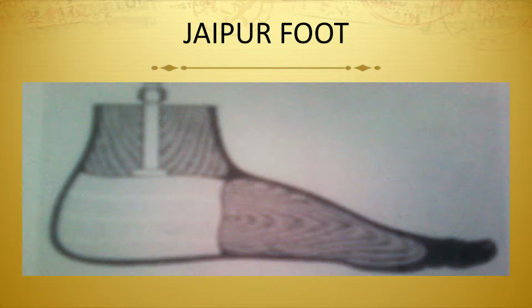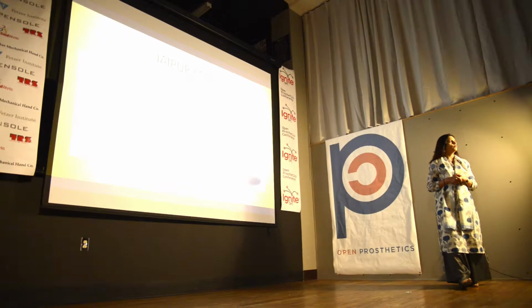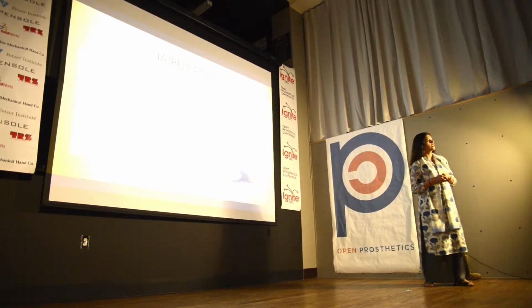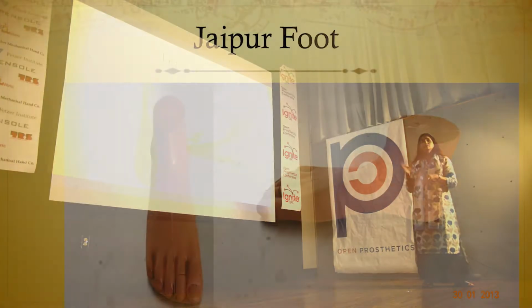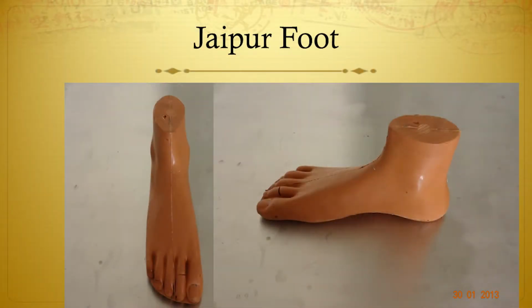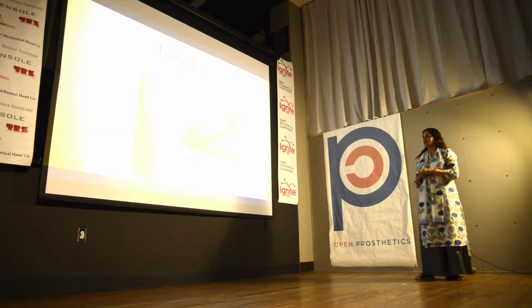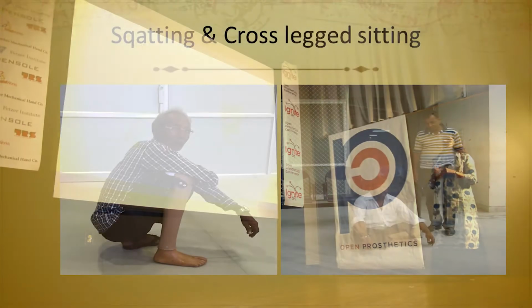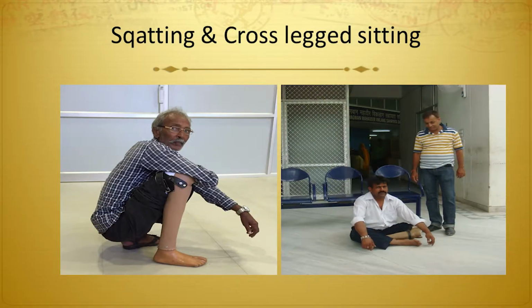Now the Jaipur foot permits mobility in all three planes. It is a foot and ankle assembly of microcellular rubber and wood encapsulated and reinforced with tire cord and cushion compound. It is very lifelike, and it was tested at the Royal Liverpool Hospital and compared with the Sach and Seattle foot and found to be more cosmetically and functionally closer to the human foot. Not just cosmetically, even functionally, you'll see that it permits patients postures which no Western foot still does.